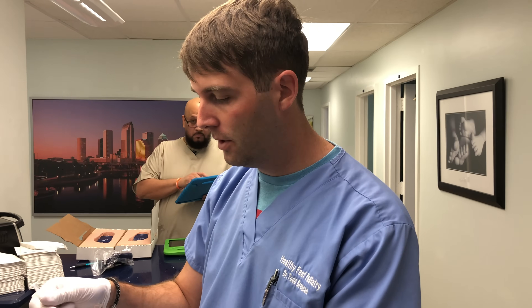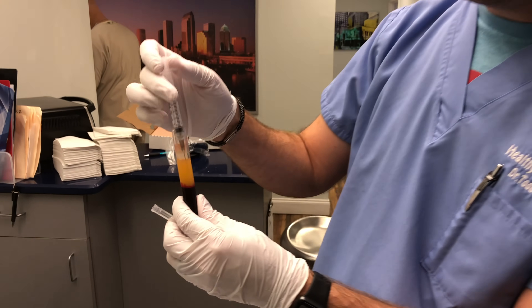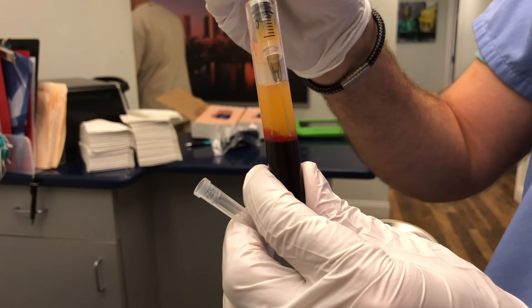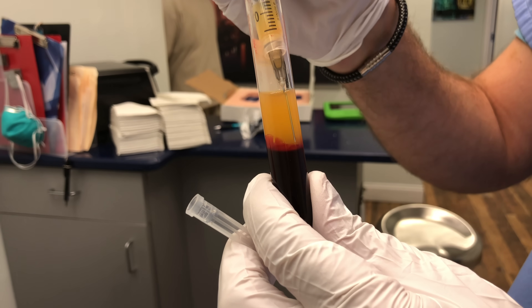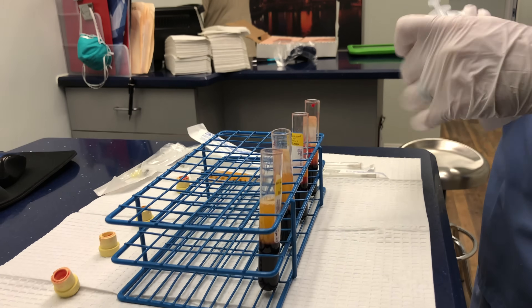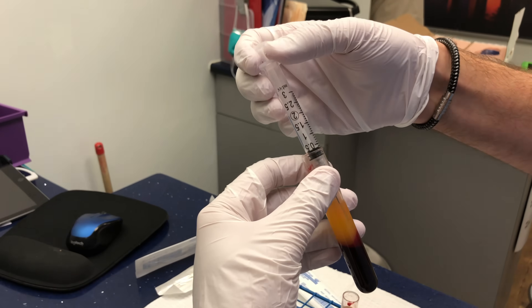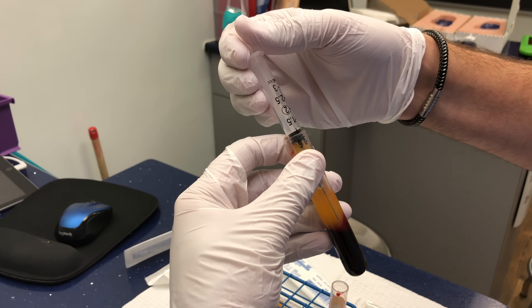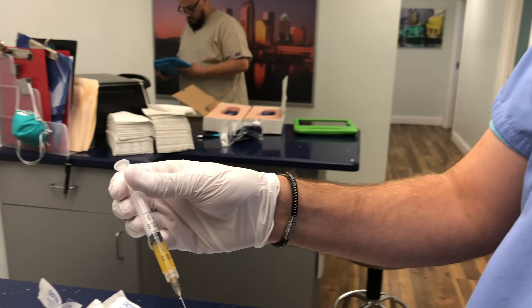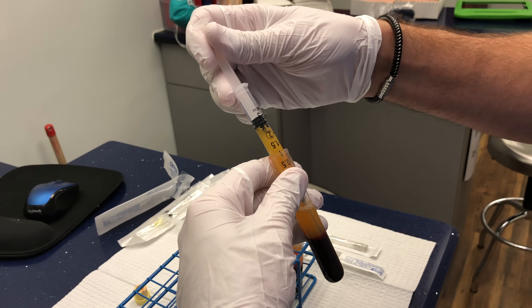So now here we have the PRP we're going to draw up. We drop about six CCs — you can see the red cells and the platelets. Usually I go kind of right above the platelets down there. We want to get that tissue layer. If you get a little bit of red cells, that's all right, but you kind of want to get that foggy layer in between. I get usually about one and a half CCs from each vial so I don't dilute out the product.